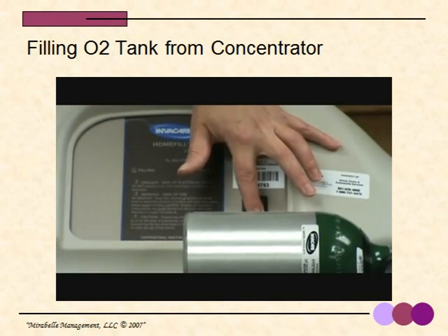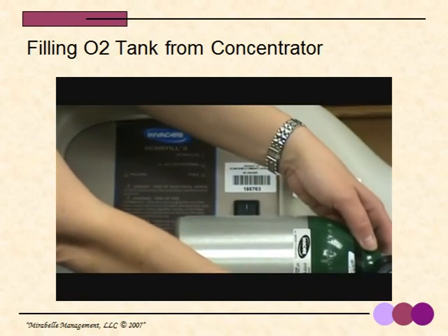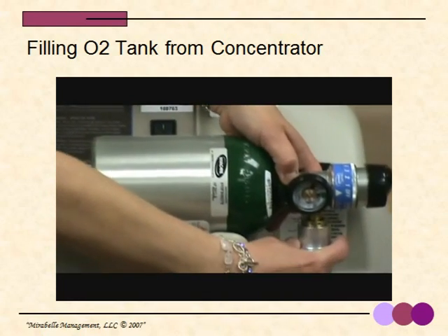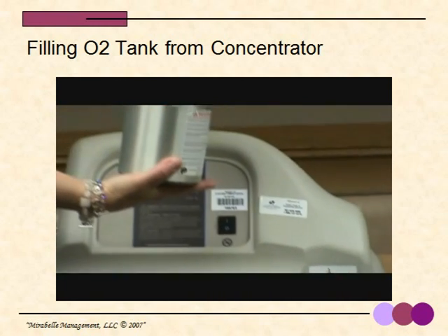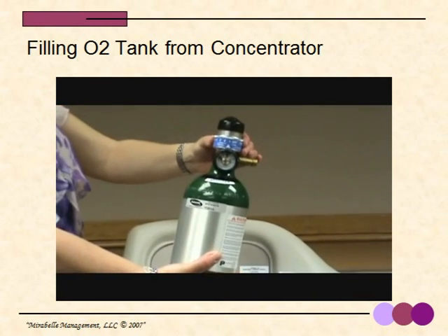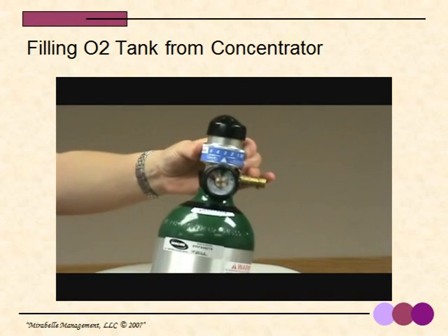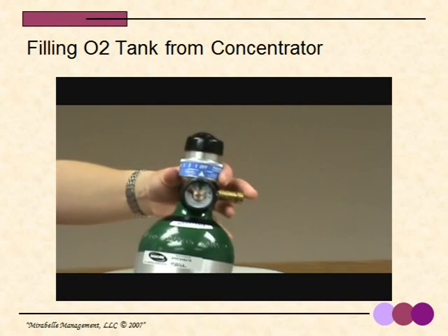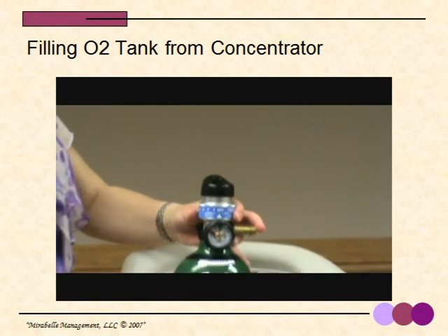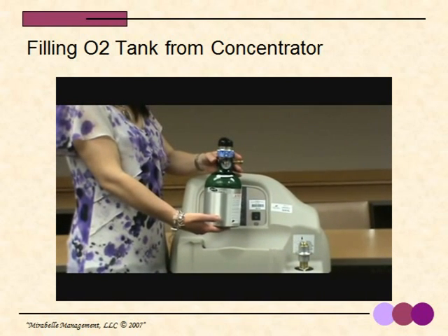Okay, now we're pretending that it is filled, and we will remove that from the main valve. And then the liter dose setting is a sleeve at the top that you can twist to the correct setting. This nice little canister comes in a little canvas bag with a shoulder strap. So now you're good to go, and you've got a couple hours of oxygen anywhere you go.